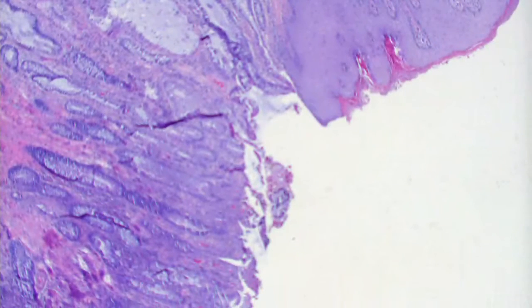Now, what's the one major item in the differential diagnosis of this? Ectopic GI tissue. And where do we usually see that? Near stomas. Yes, like a stoma reaction where you get GI tissue that grows onto the skin. It's a kind of metaplastic process. So that can look exactly like this without the polyp. If you have a little magnification and you see that it's a polyp or a little papule, you can make the diagnosis. But if you just had this, peristomal gastrointestinal epithelial metaplasia could look exactly the same. And that's usually pretty red and irritated and inflamed also.